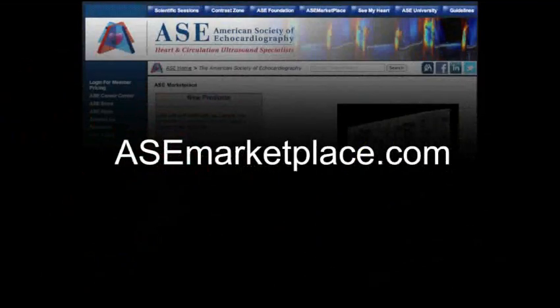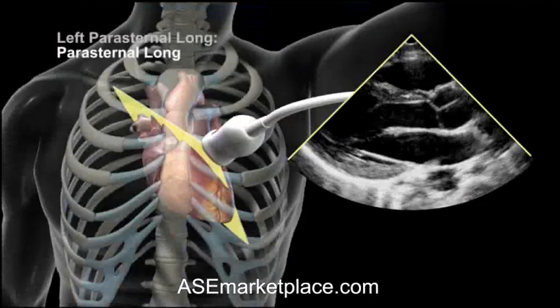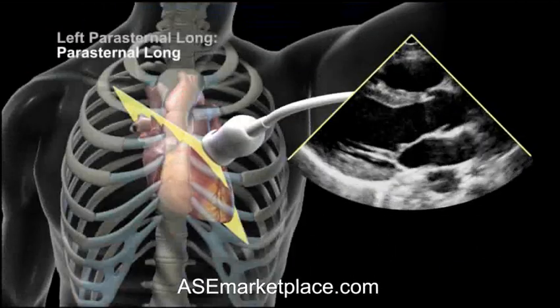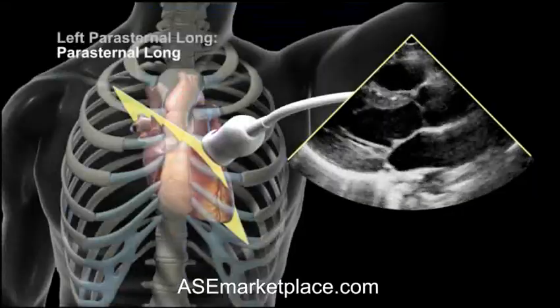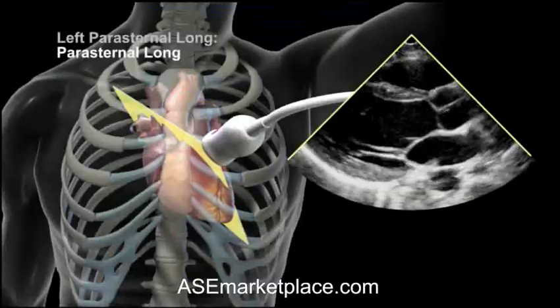Please enjoy this clip from the DVD and be sure to visit asemarketplace.com for more information. The first view is simply called the parasternal long view.